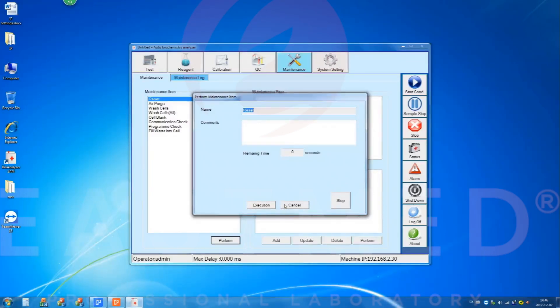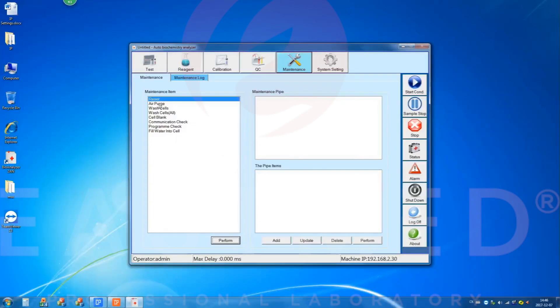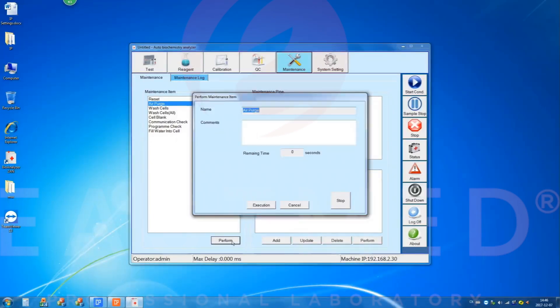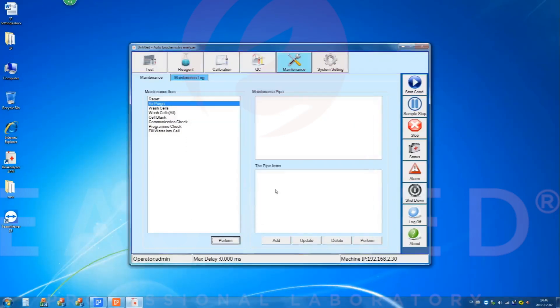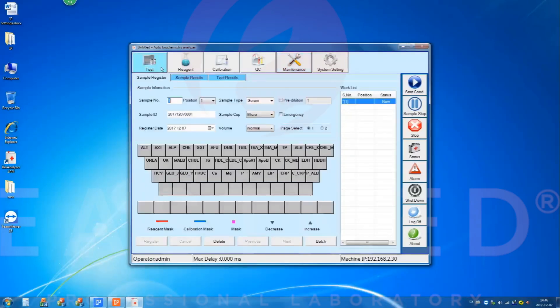Click to execute the air purge function. All pumps and solenoids start to operate. Please check if pumping, cleaning, and discharging work normally. For first-time installation or after replacing the bucket, perform the air purge function 3 to 5 times to remove trapped air.